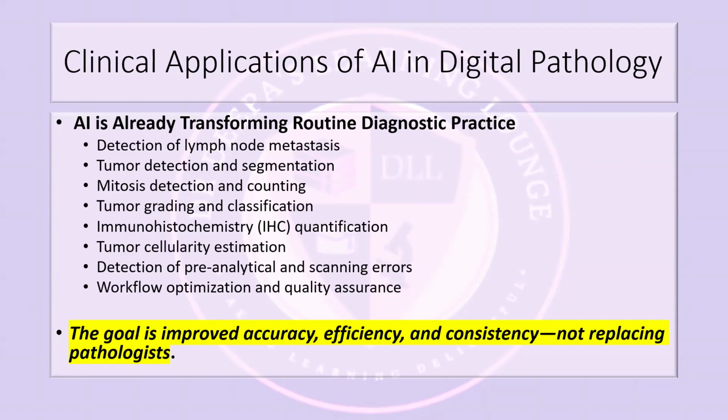It also performs exceptionally well in mitosis detection. Mitosis detection is a time-consuming, cumbersome, difficult process when you're looking at malignancies day in and day out. And there is considerable inter-observer variation. Mitosis detection is the worst for inter-observer variation.